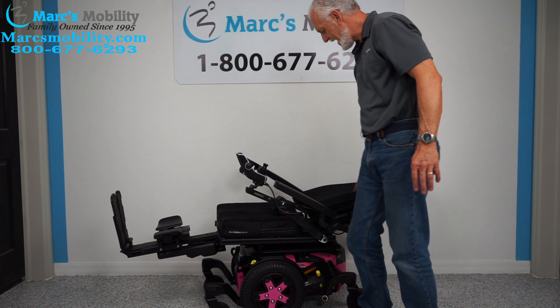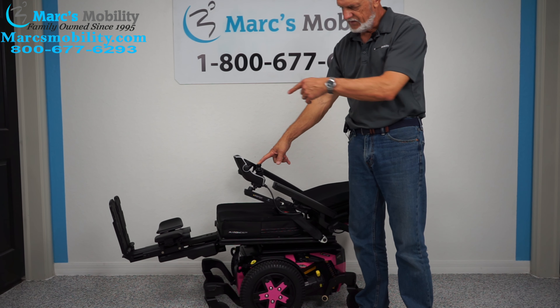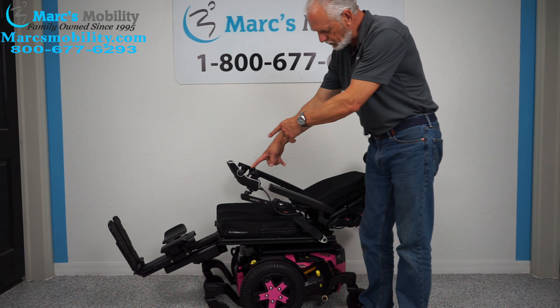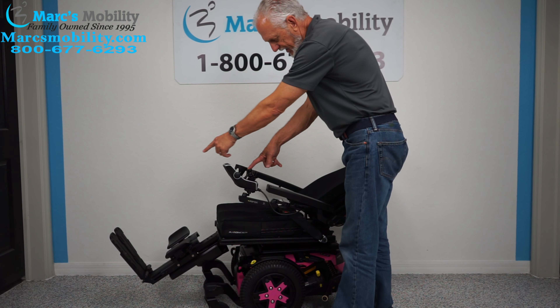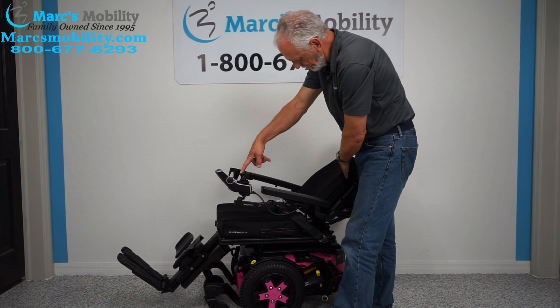What I'm going to do now is bring the back and the legs up and down at the same time with one button. On your screen, I have the feet highlighted yellow and the back yellow — that will bring both portions back to normal.